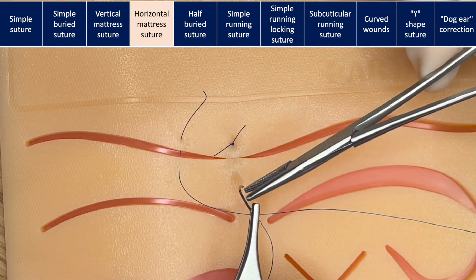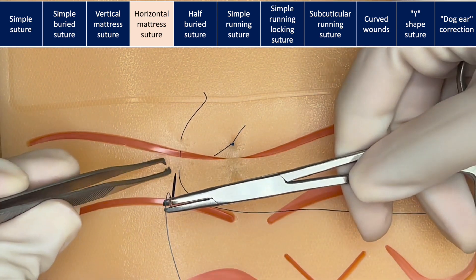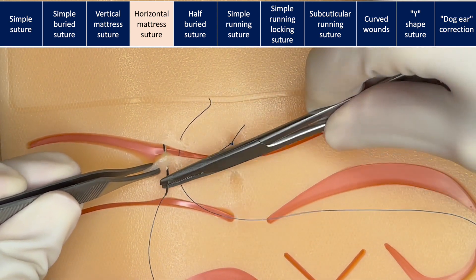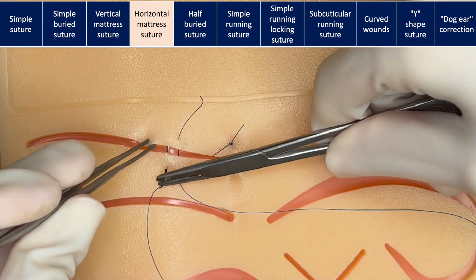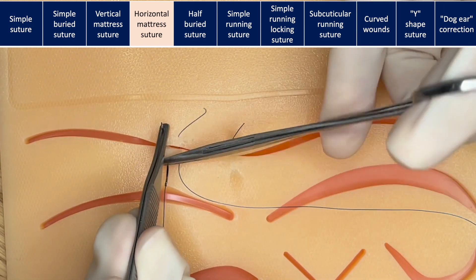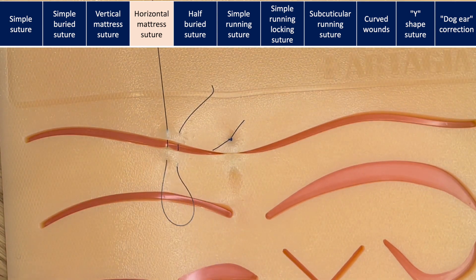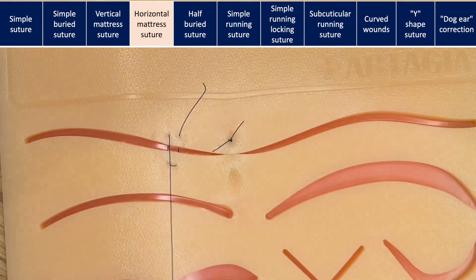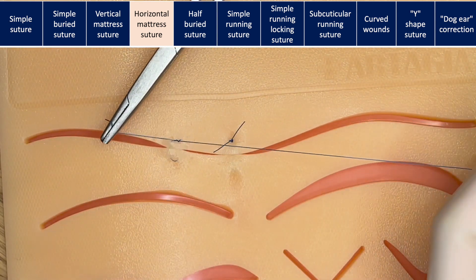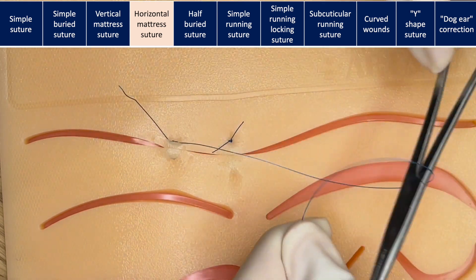Instead of tying a simple suture, turn your needle around, advance the suture, and move the same distance as your simple suture, entering in the same way almost like you are doing a simple suture on the other side. You will go back so you end up on the same side. Tie the suture strands together and cut. This type of suture has the advantage of being faster than two simple sutures.